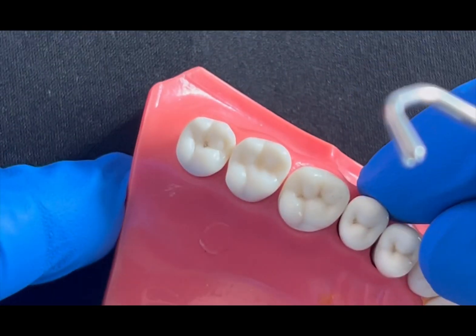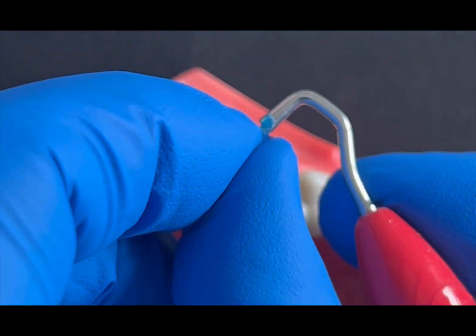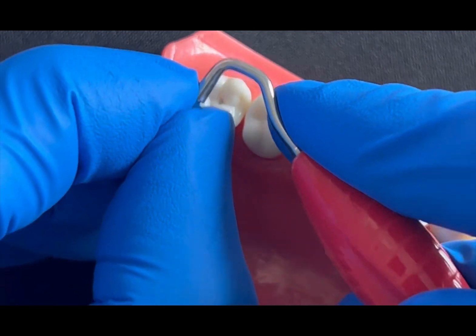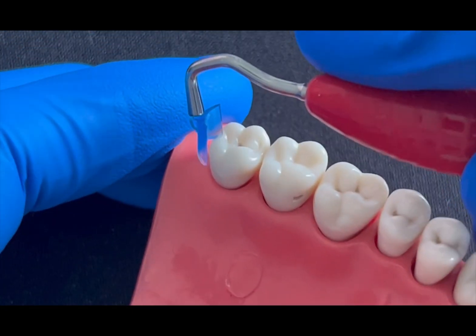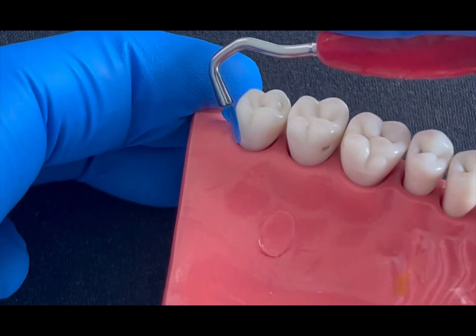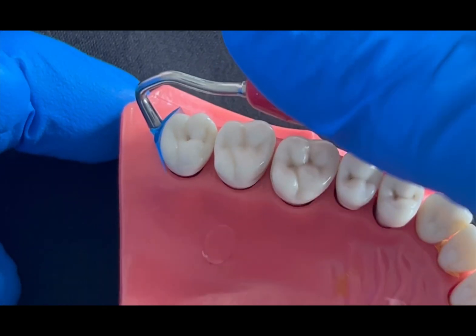If I want to use the other end, which is multi-angulated, I can use it for the distal-most aspect of my molars. I fit the extra large tip and get it fit around the molars and get them restored. This is how it fits.